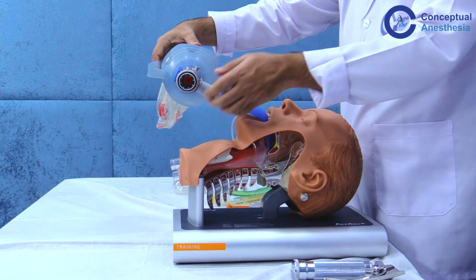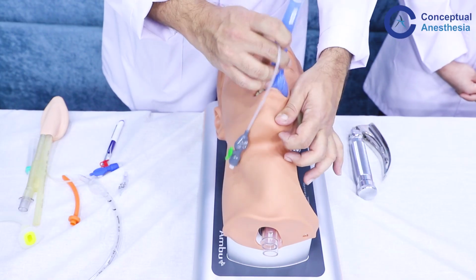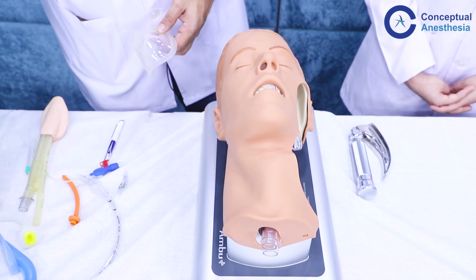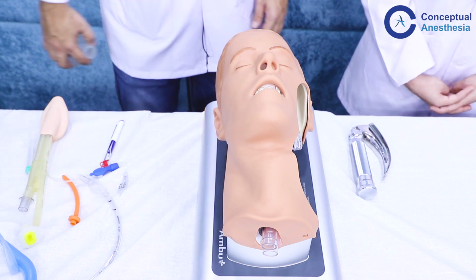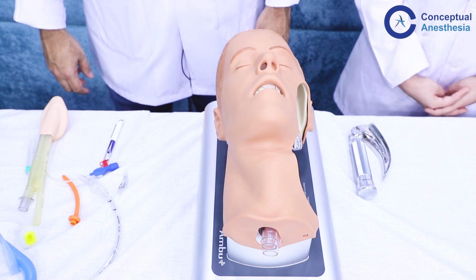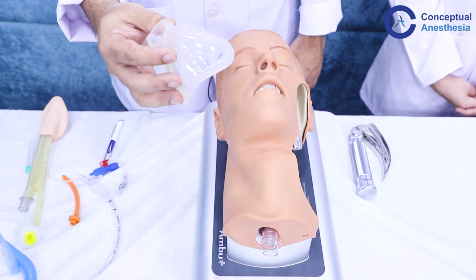Okay. Now, suppose we are not able to put in the LMA at the first attempt also. Then I have a chance of 3 attempts to put the supraglottic airway device or the laryngeal mask airway. Okay. Now, if in 3 attempts also the supraglottic airway device is not going in, then the next thing I do to maintain oxygenation to my patient is I mask ventilate this patient. So, we will show you the ideal technique of holding a mask on the patient's face.